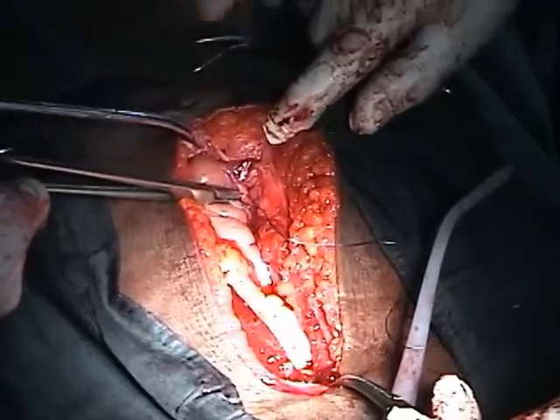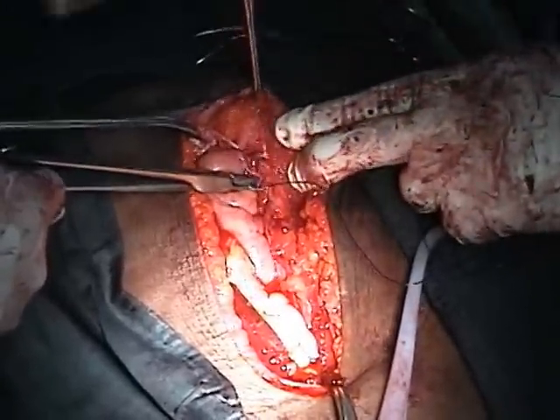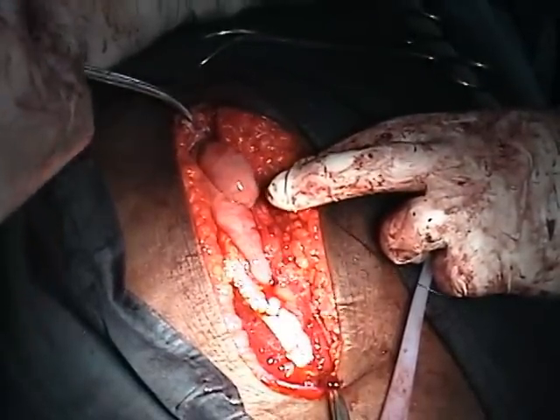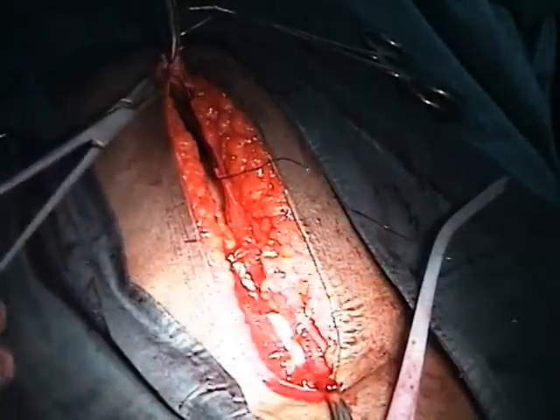So once everything has been checked, swabs and instrument counts correct, the next thing is to close the abdomen. And here the closure starts with the closure of the rectus sheath. And since this is a midline incision, which, like we said earlier on, doesn't heal as well as a transverse incision, we are using a permanent suture, which is nylon, to do the closure of the rectus abdominis. That is a better suture for preventing wound dehiscence.